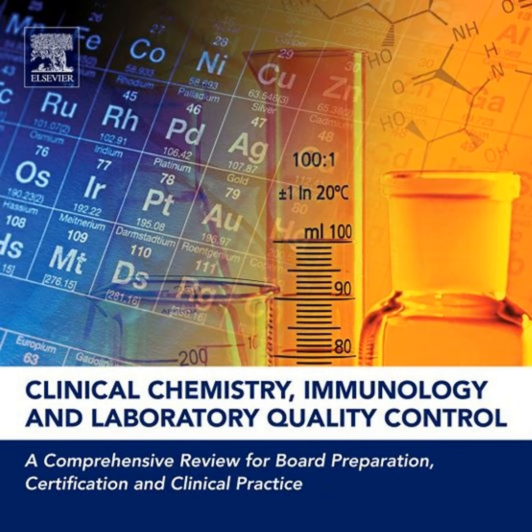And we also have to remember that a negative toxicology report doesn't always mean the patient is drug-free. Correct. Exotic substances like magic mushrooms, peyote, and synthetic compounds like bath salts or spice are generally not detected by routine immunoassay screens. The assays just aren't designed to see them. Exactly. You need specialized chromatographic methods.